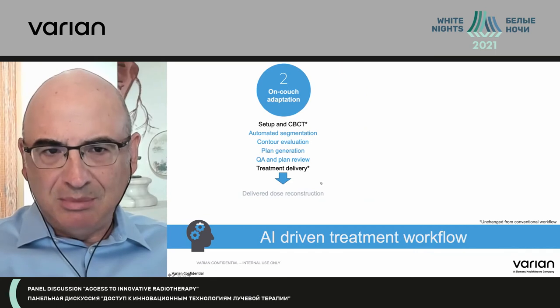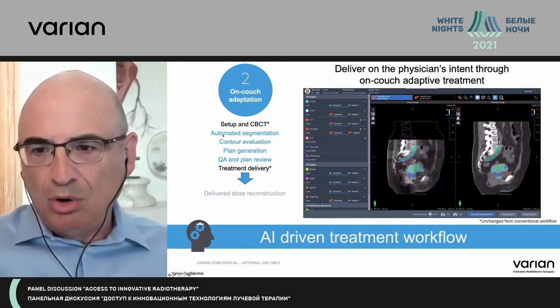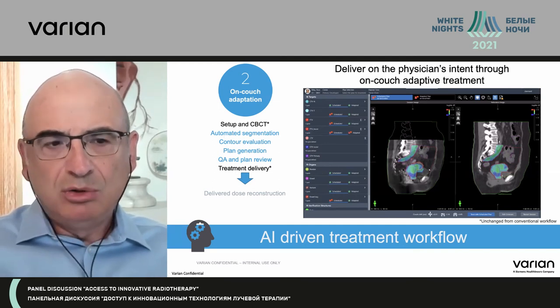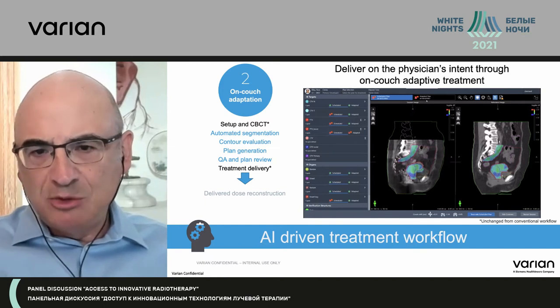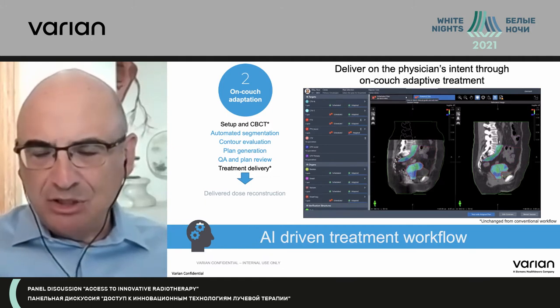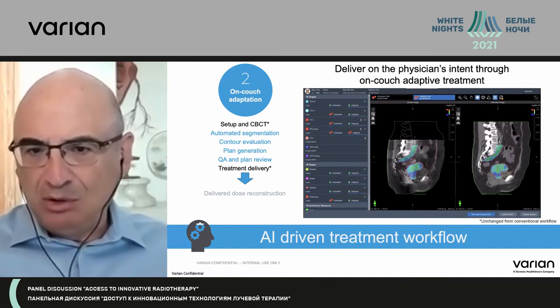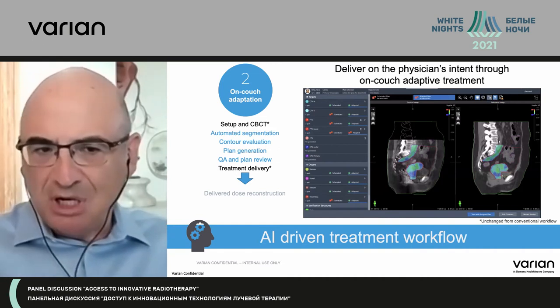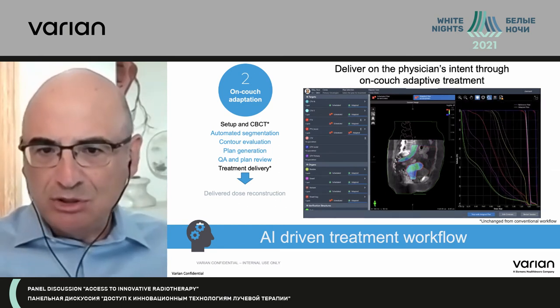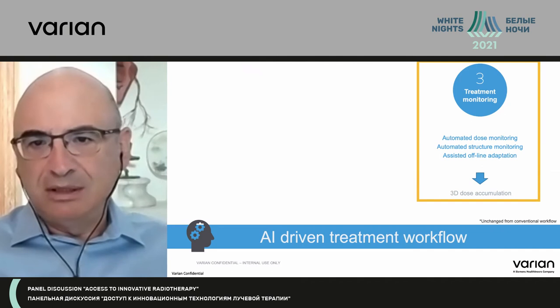More importantly, during the time the patient is on the table — the on-couch adaptation — the system does automatic segmentation of all organs at risk, so you only have to check that they're correct. There are very easy tools to correct the anatomy. You can see it's pointing out the bladder that's now sitting in a different position — it's higher. The system then automatically generates a plan: the adapted plan versus the scheduled plan, and you pick the one you want. If things haven't changed much, you keep the scheduled plan; if things have changed, you take the adapted plan. The QA is done by an independent software check, and then the treatment is delivered.